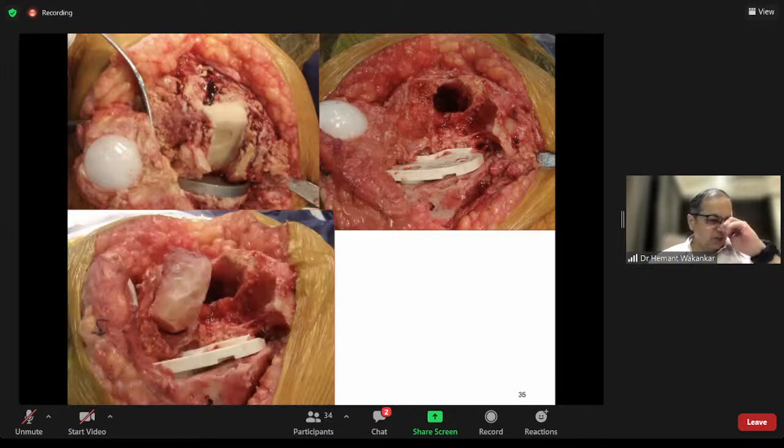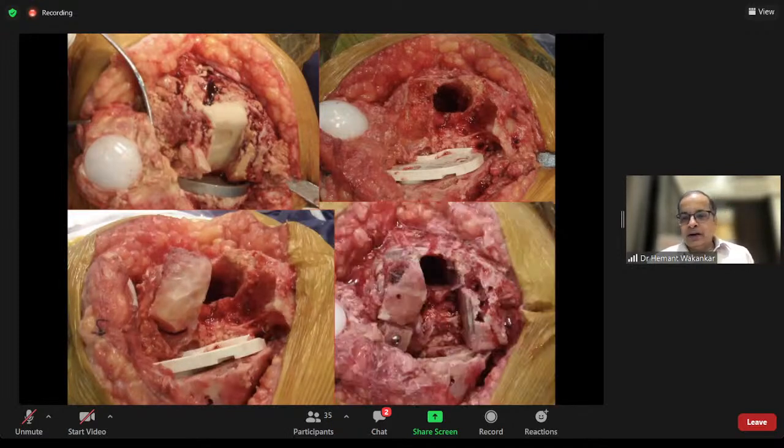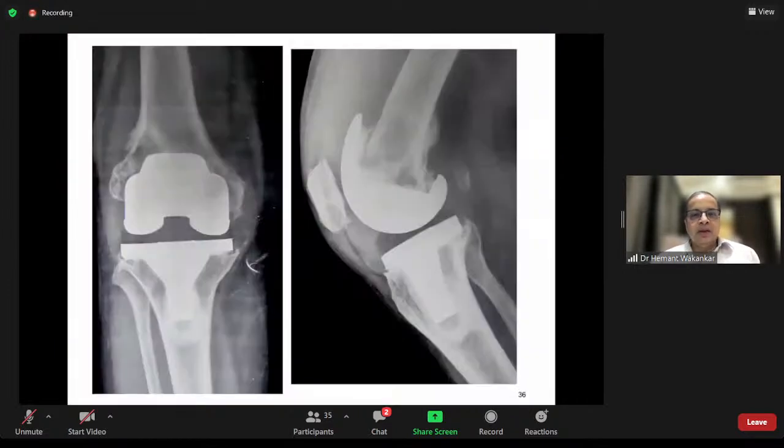And here I have used a femoral head that was refashioned into a condyle, and both the condyles have been reconstructed using the fresh frozen allograft. And in such scenario, one needs to have a good metaphyseal cementation, at least, if not fully cemented, because your bone at the level of the joint itself is not going to be very strong. And one has to really have a good cementation of the stem.